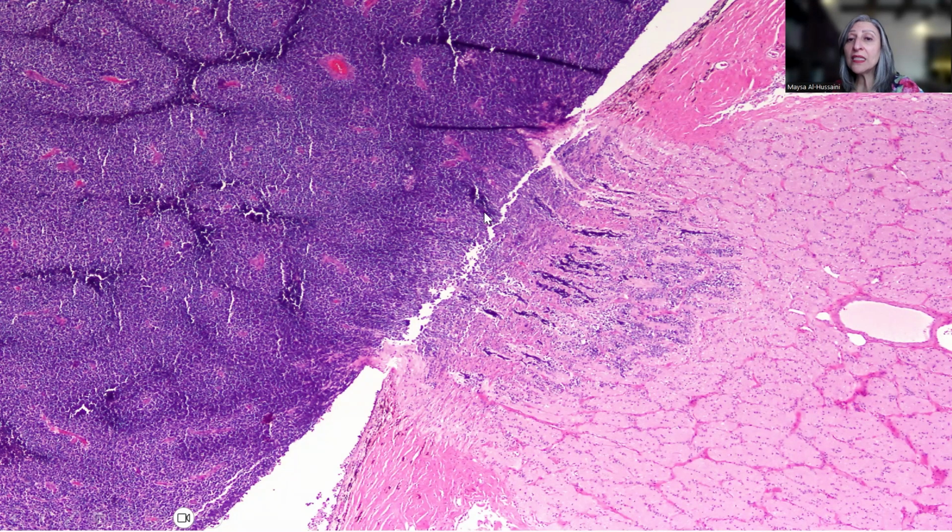We can see that the tumor has infiltrated or invaded the optic nerve beyond the limits of the sclera. So this is post-laminar invasion of the optic nerve, and the optic nerve fibers actually enter through the sclera, through the lamina cribrosa, and involvement of the optic nerve, especially post-lamina cribrosa.